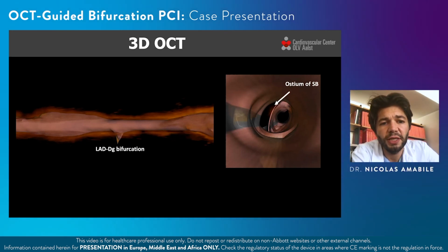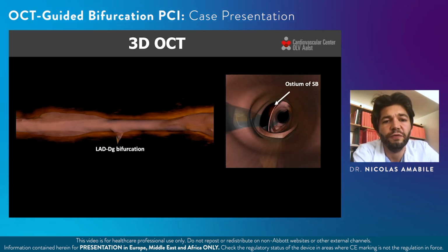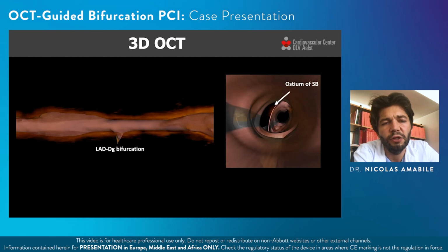Adrian, I think that's a great case. It's a very challenging situation, and my initial plan would be not to treat this patient with CABG, but rather do a PCI. Of course, the challenge is that there is already one layer of struts within the artery. So I would try not to put other stents in this previous stent, and maybe analyze the reason for the in-stent restenosis and potentially go for a drug-eluting balloon after OCT and potentially also post-dilate the previous stent.